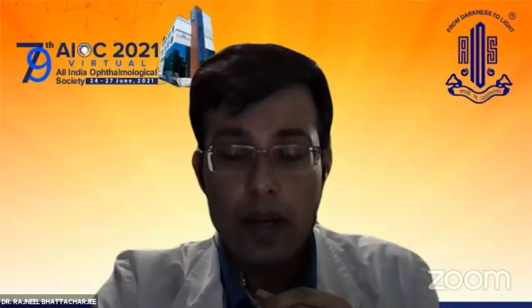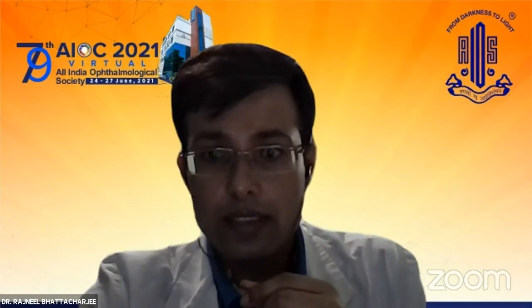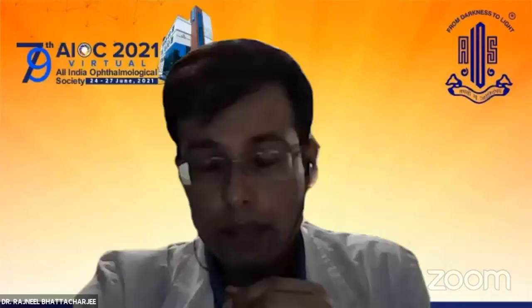Dr. Rajneel, yes, sir. Could you tell us what A-scan you had used to measure the axial length? Sir, that is infrared optical A-scan, Metronics, sir. We use that one to measure optical infrared, sir. And this one for the keratometry reading? That's Bausch and Lomb keratometer, sir. Was it a manual one? Sir, pardon, sir? Was it a manual keratometer which you used? Yes, sir. Manual keratometry, yes, sir.